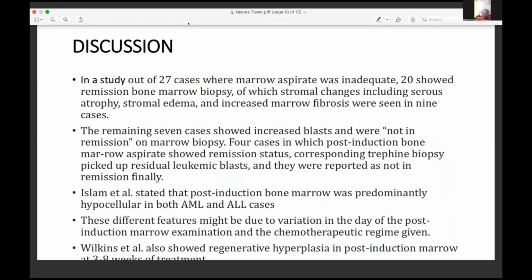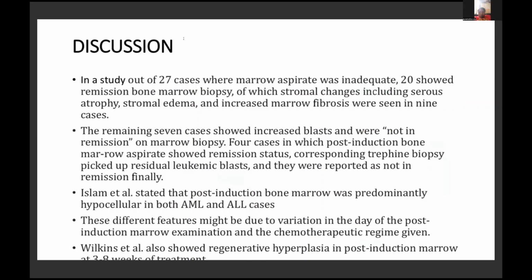So basically, this is part of a larger study where, by using immunohistochemistry, we are trying to analyze the percentage of CD34 positive precursors in bone marrow aspirates where the setup is resource poor and does not have much access to flow cytometry or molecular testing.